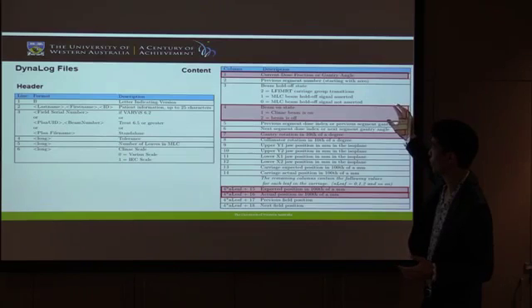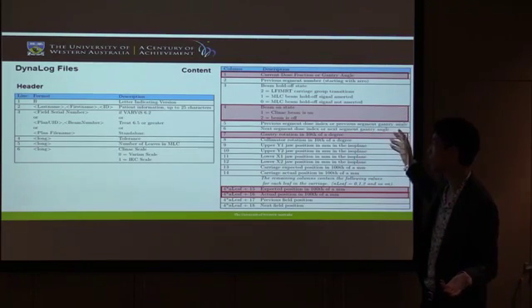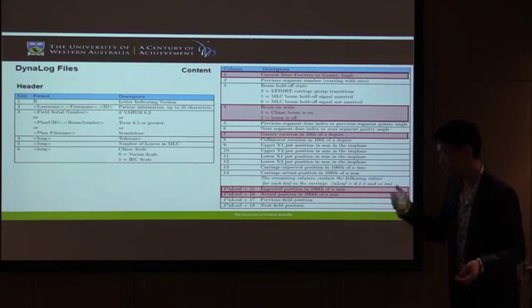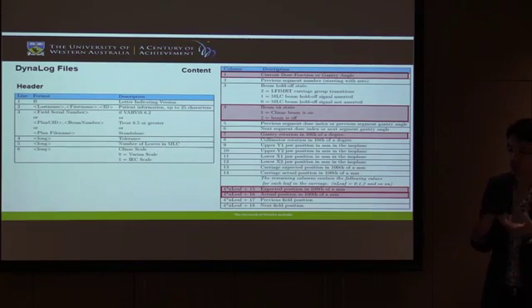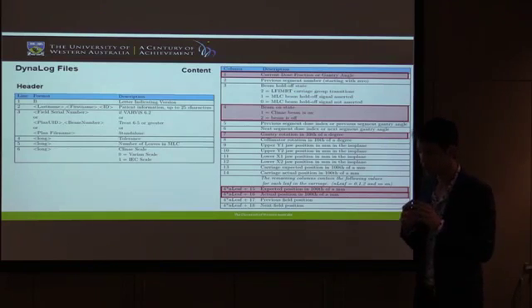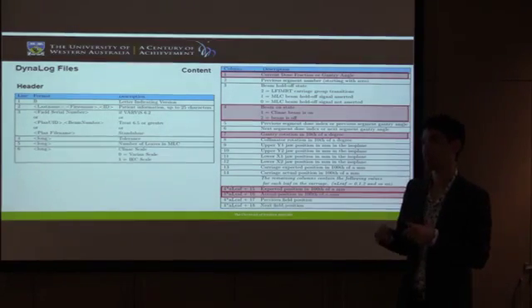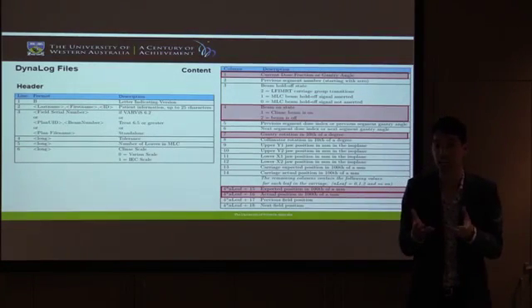It also tells you whether the beam is delivering radiation or not, if it's on or off, the gantry rotation, collimator rotation, and as I said before, the expected and actual positions of all the leaves on all the banks at all the time steps. The expected and actual leaf positions are recorded in relation to the center line.